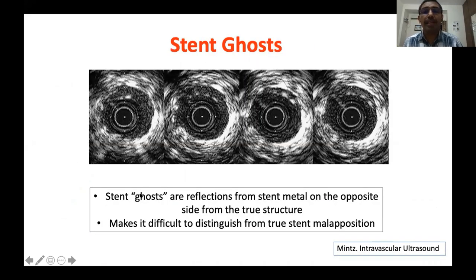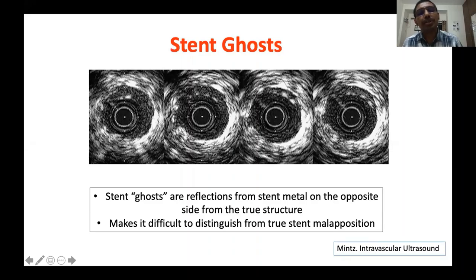Stent ghost artifact: reflections from stent metals from the opposite side that appear as true structures. You should not mistake this for true stent malapposition. This is a typical ghost artifact of stent struts — actually a reflection from the opposite side, not a true structure. Do not mistake it for stent malapposition. This completes the presentation of image interpretation.